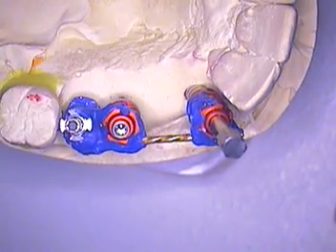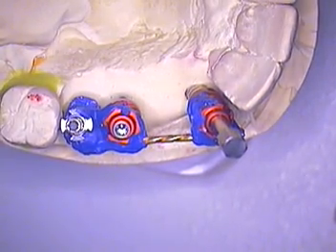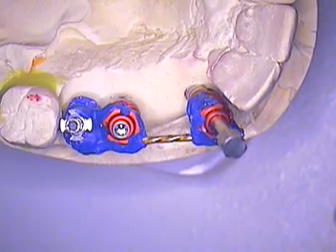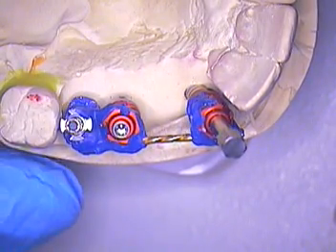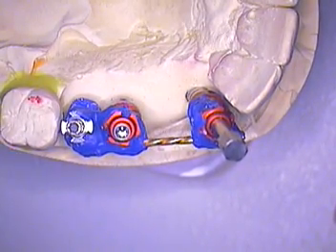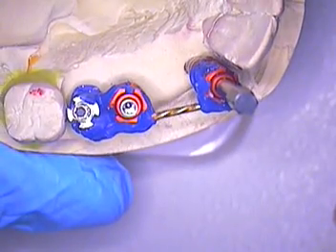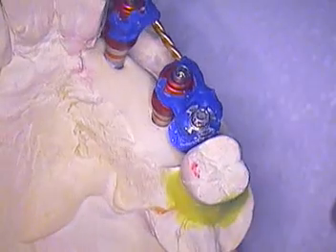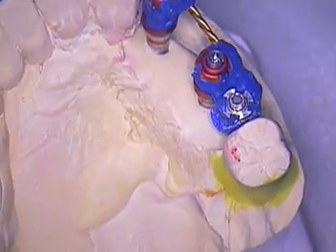Hello everyone, this is Dr. Jerry Cuomo. I'm here this evening with another great implant case. This one has actually been placed in the mouth for at least a year now, but I managed to find the old model work and I wanted to discuss the actual assembly — basically foolproofing and bulletproofing this case with a technique I've been very accustomed to and have discussed in other videos. So let's get right to what I'm showing you here.